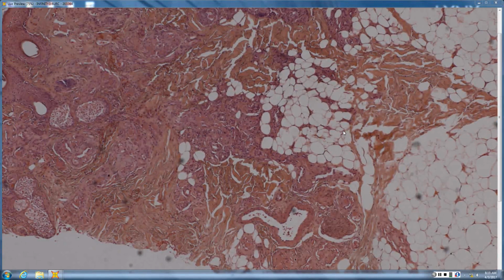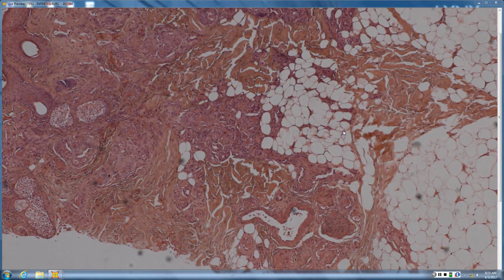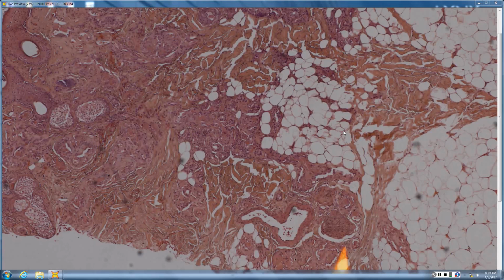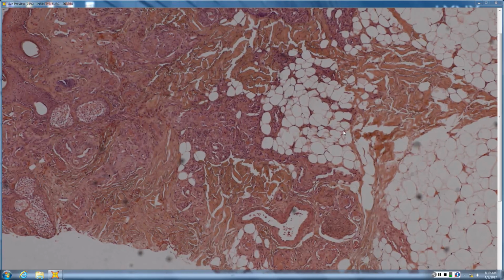So this one's really kind of forming clumps around the eccrine coil. It really is patchy and forming clumps around pre-existing structures, which first makes you think of Kaposi. At first want to get an HHV8. So first stop is an HHV8, which in this one happens to be negative. So then I want history. And this is a chronic, slow-growing thing, and it has these cleft-like spaces, and they ended up going to a soft tissue person who called it a retiform hemangioendothelioma, basically low-grade angiosarcoma. But I agree, your first stop would have been an HHV8 for that tumor.